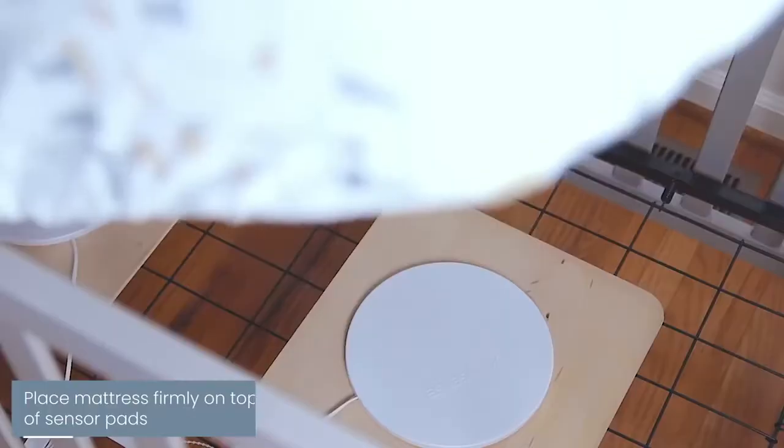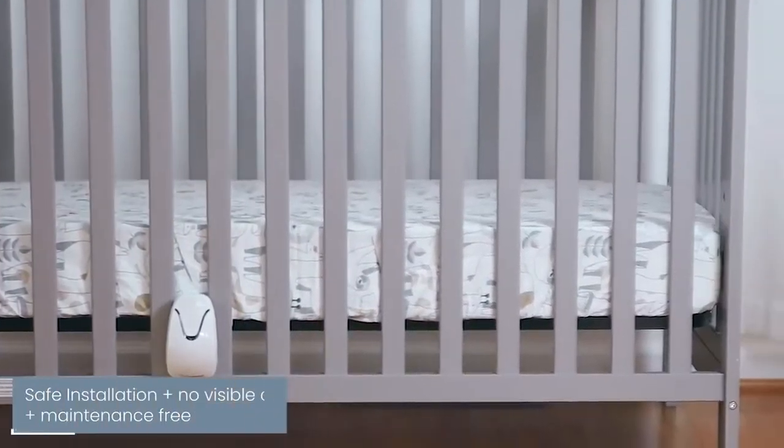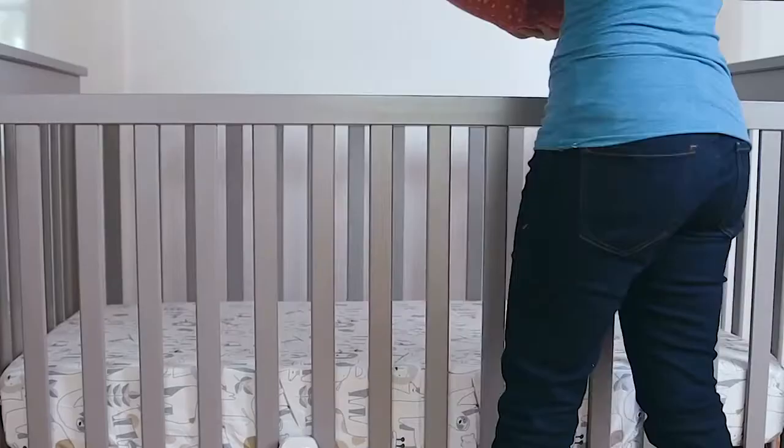Place the mattress firmly on top of the sensor pads, ensuring good contact between the sensors and the mattress. One time installation — that's it, it really is that easy. With no visible cords and no direct contact with your baby, you can be sure your baby is safe.